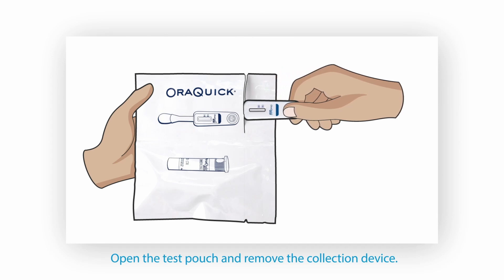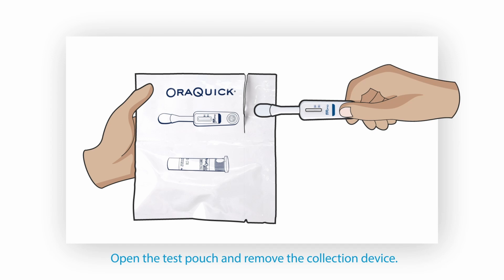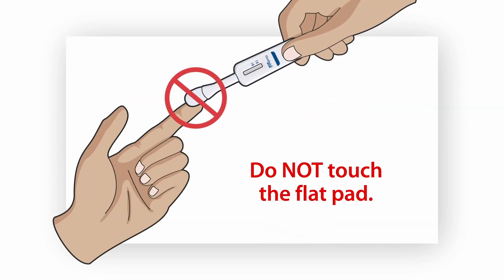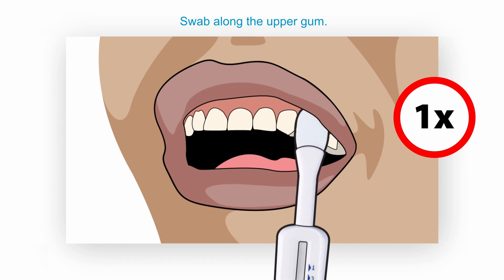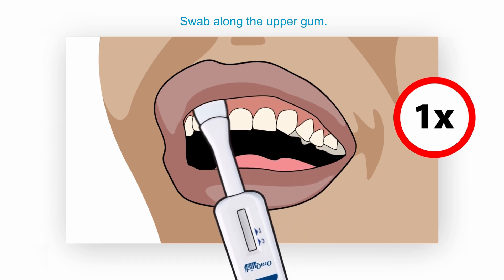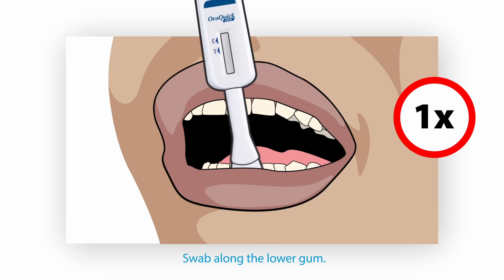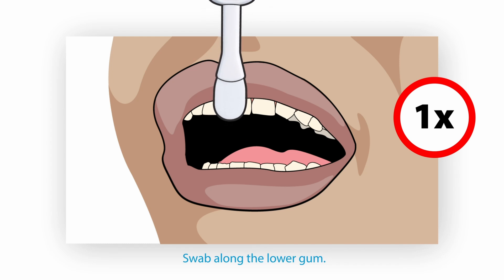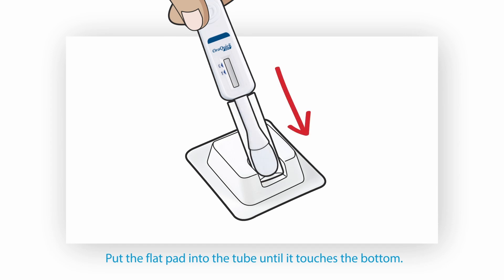Next, open the test pouch and remove the collection device. Take note not to touch the flat pad on the collection device. Using the collection device, swab the flat pad along the upper gum once. Using the same collection device, swab the flat pad along the lower gum once.